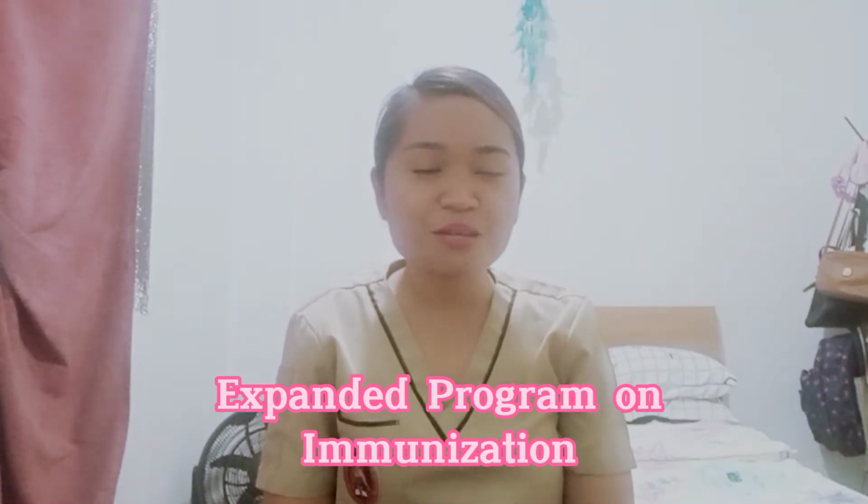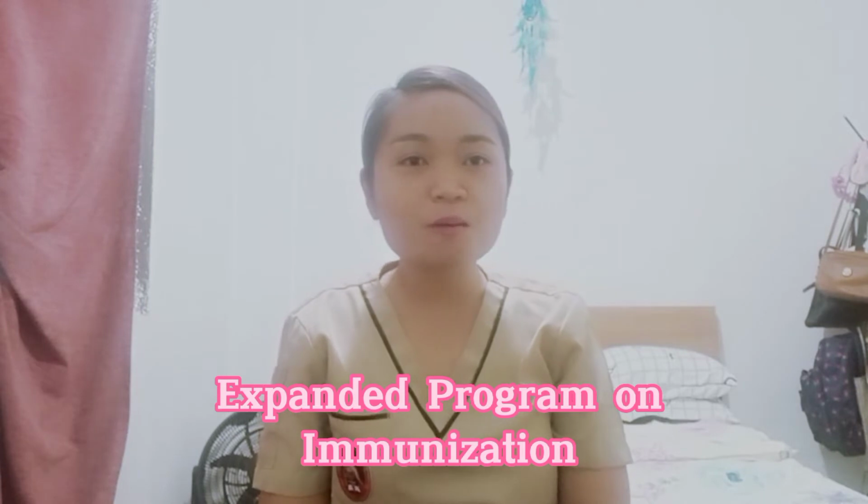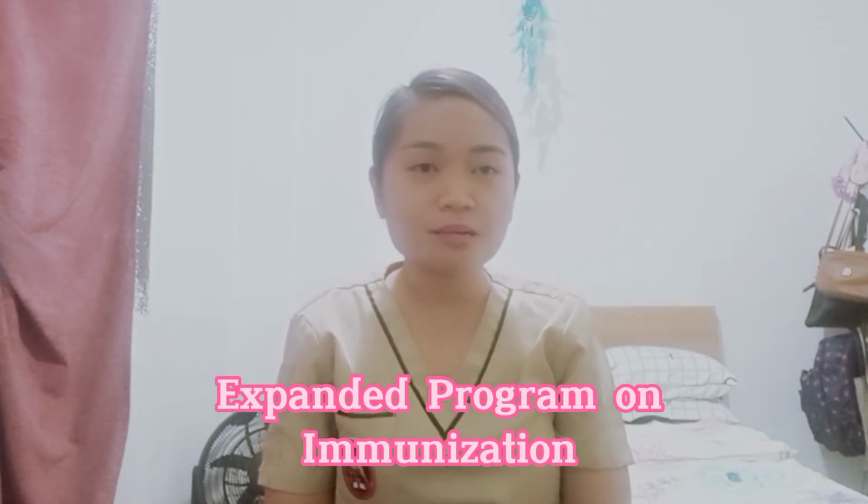Hello everyone, my name is Christy May Talang, and today I'm going to do a return demonstration on a proper way of doing an immunization.